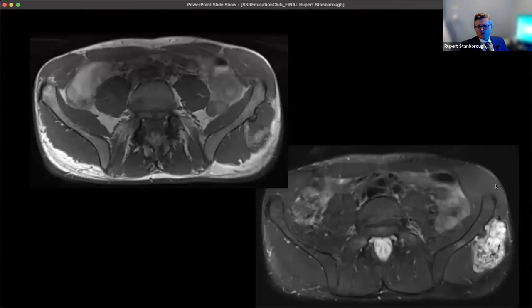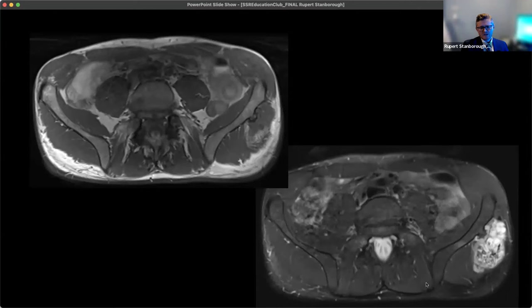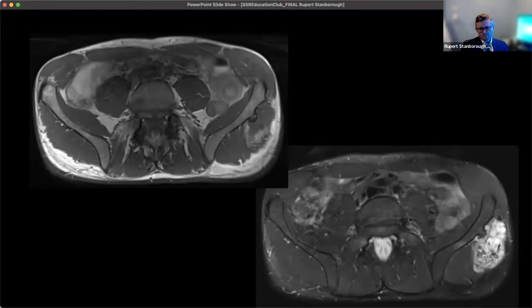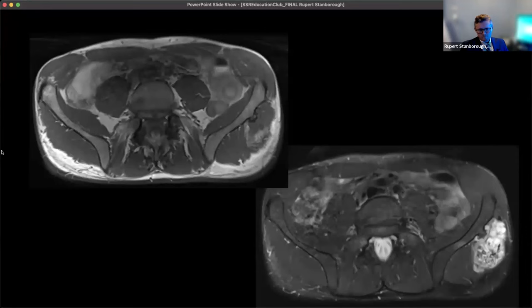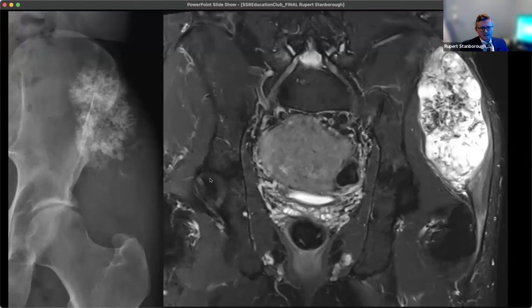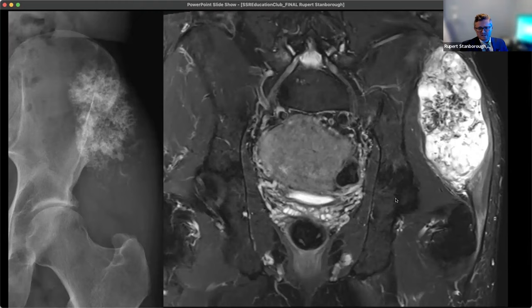Here are two images of the upper pelvis: the axial T1 and the axial T2 fat sat. I specifically chose this slice at the upper aspect of the mass. Think about why I picked this slice and what added value it's giving us to help make the diagnosis. Those areas of mineralization on the radiographs now show as signal void on MRI, which is what we would expect. The mass appears bigger than expected just from the radiograph.